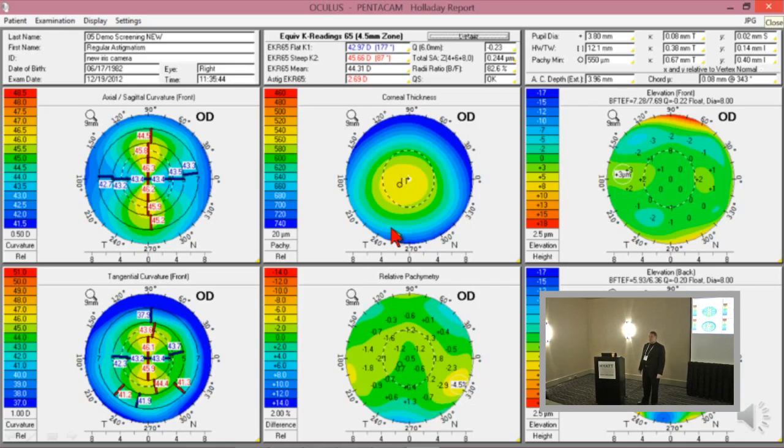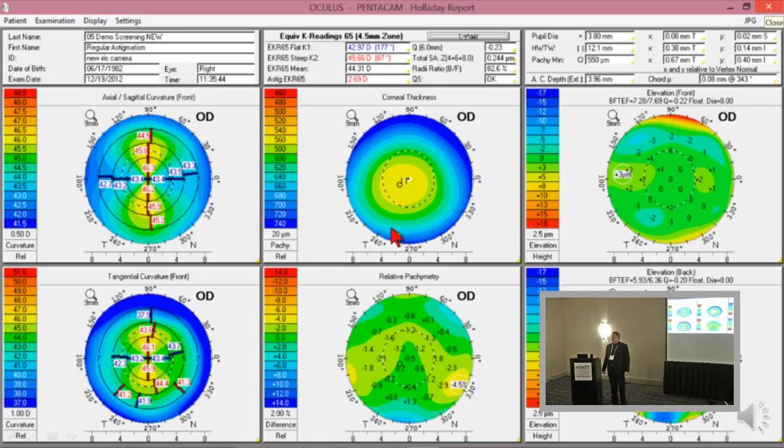And we're going to see in people where that's not separated by a small distance, it's going to be a flag to us that something's wrong with that cornea. Okay? So when that thinnest point is not where it looks like there, a little temporal, then we know that that's a problem. But the exact values are in the upper right.